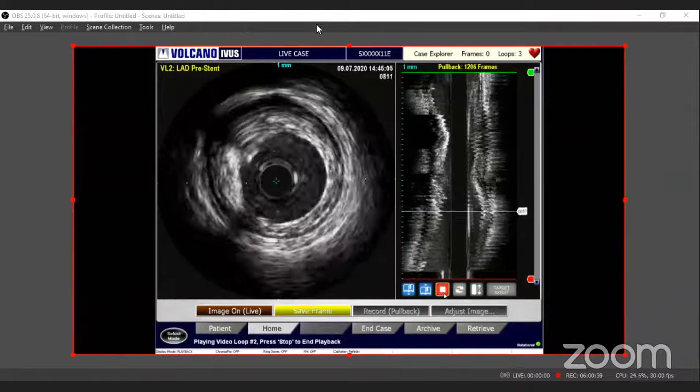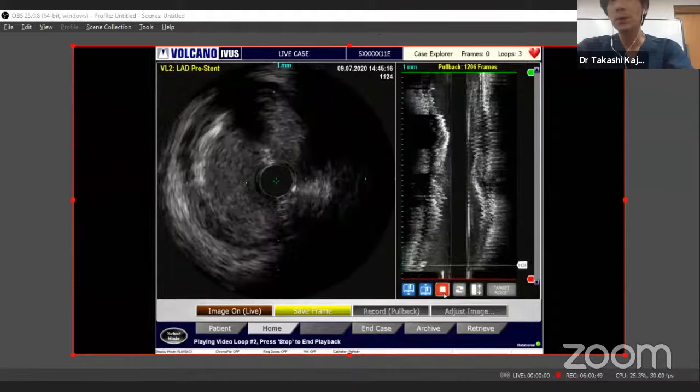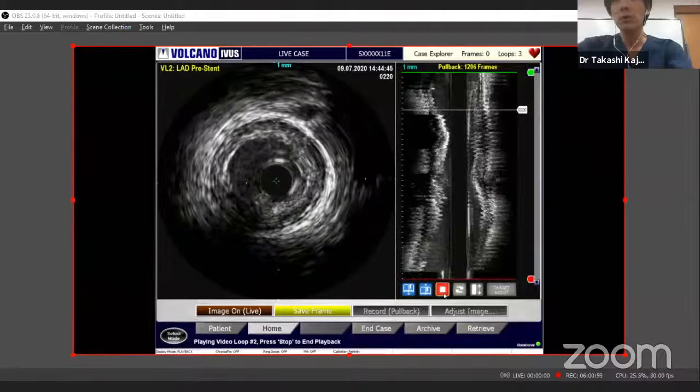The Rossi's lecture, he said, you know, more angulated vessel, we should stent first. But sometimes if we see a heavy plaque for main vessel, maybe the first stent should be stented in main vessel. So maybe we should discuss which one first.